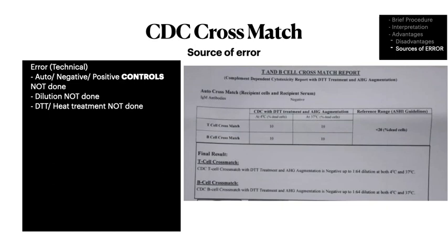One is we can uncover a prozone phenomenon. Sometimes there are very high antibody titers, and because of the prozone phenomenon the result can be falsely negative. Second, it gives a semi-quantitative way of knowing how much antibody there is. If the antibody continues to exist up to 64, it means the antibody titers are very high. So it's a way of knowing the antibody titers.